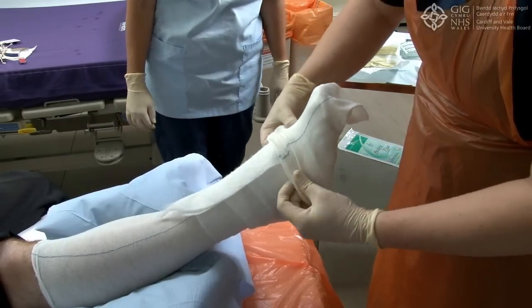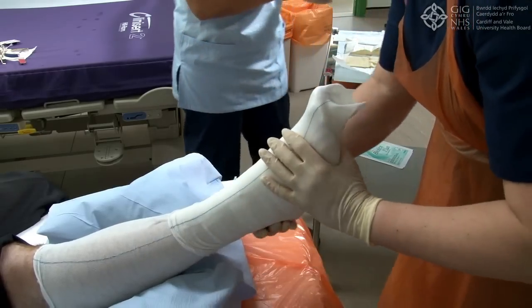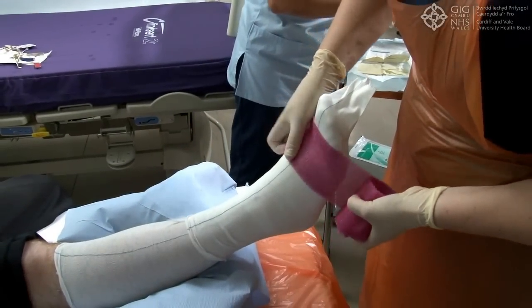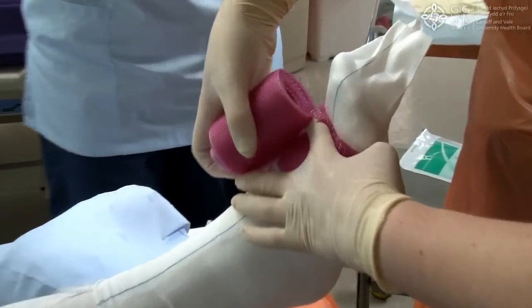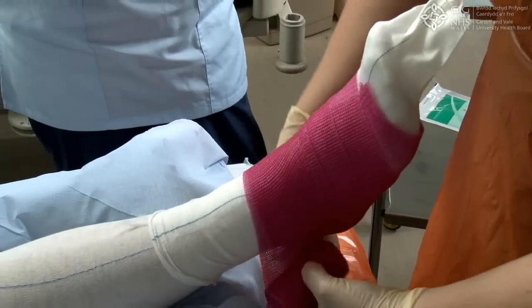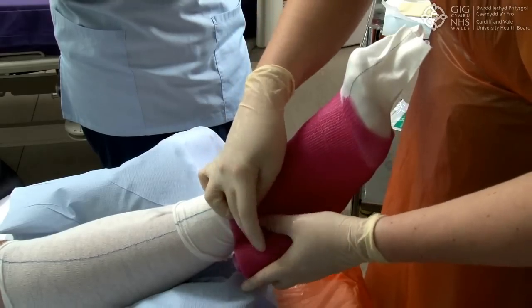Apply another layer of blue or yellow line Tubifast from just above the ankle to the toes, ensuring there are no wrinkles or creases. Apply the semi-rigid casting tape, working from just below the toes, overlapping the semi-rigid casting tape by half, just above the ankle, ensuring you apply enough tension to prevent creases and wrinkles.